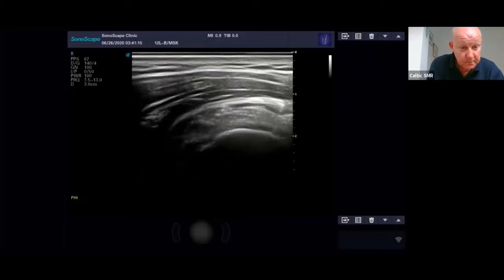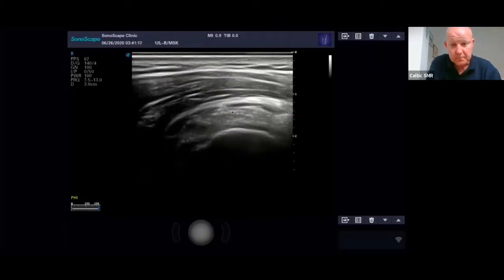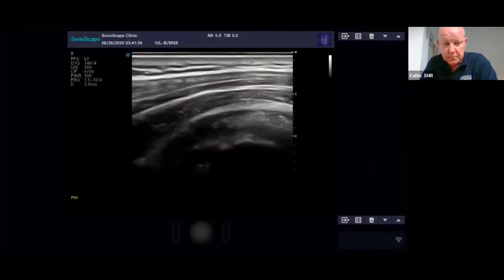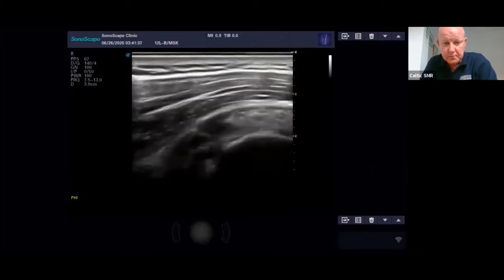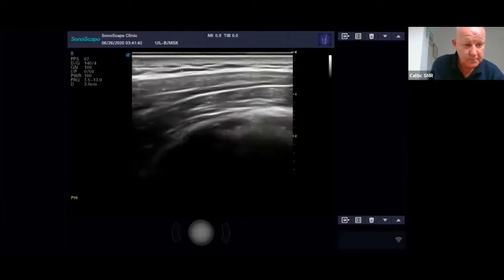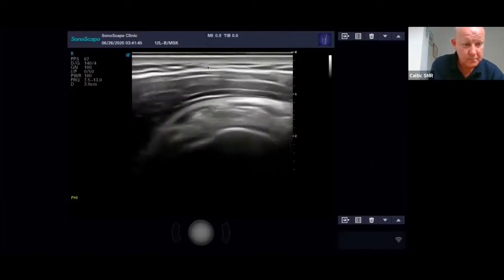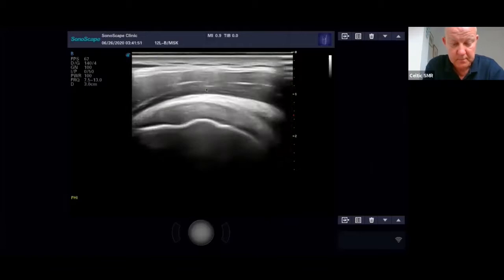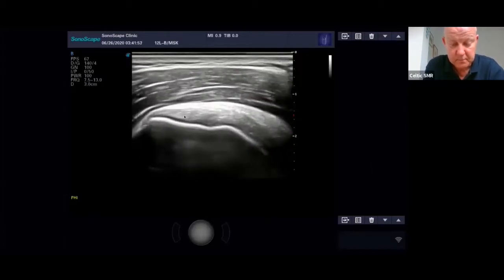Did you get the differentiation of the levels here well enough? So you've got the skin, the subcutaneous fat here, then the muscle, and then down into the bursa and the tendon, and then the bone. So it's really good to get these delineations. If you go on the muscle, you'll see the fibers moving backwards and forwards, whereas the septi remain pretty still, but you can see the fiber differentiation through the muscle. And if you go into long section, you'll see that in the tendon as well.